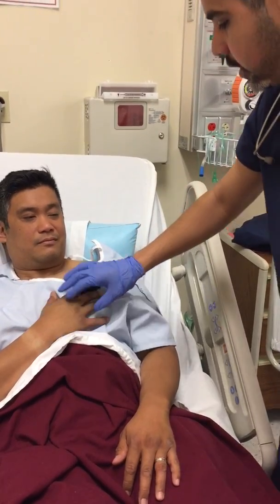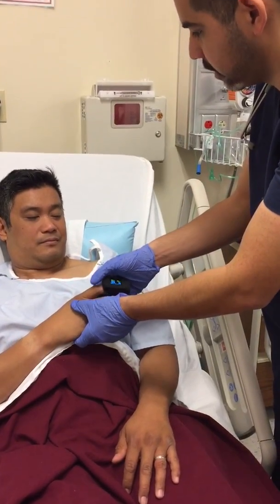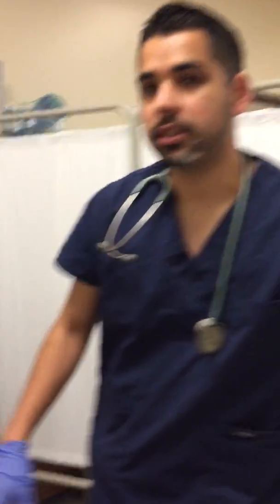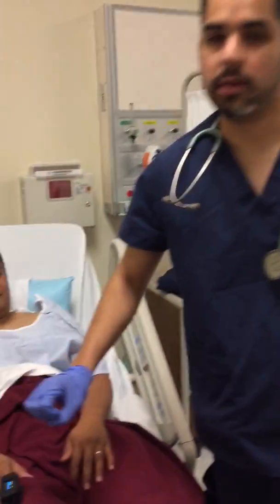Okay, thank you very much. I'm just going to leave this on here for the time being, okay? Do note this information. Saturations are 98. That's good. Doesn't need any oxygen to be administered. His pulse rate I counted in 30 seconds times 2. I got 80. And then his respiratory rate, he breathed about 6 breaths. 6 times 4 is 24.